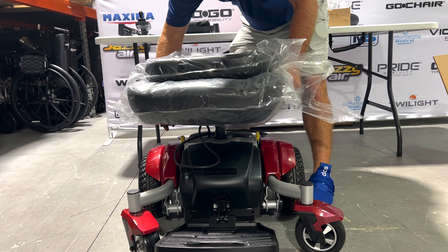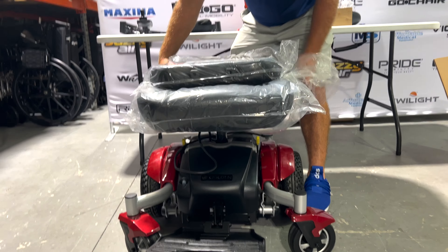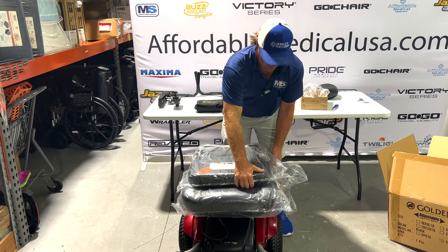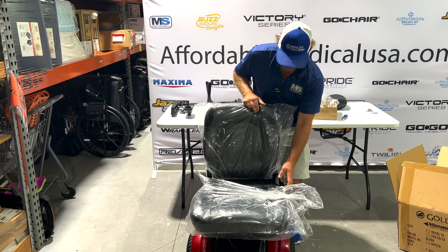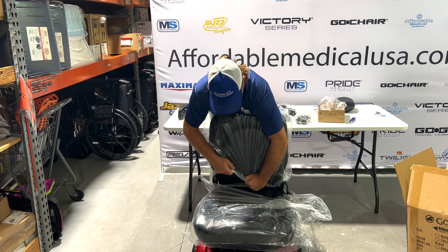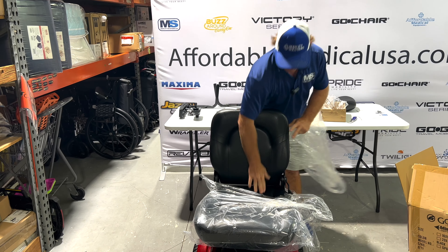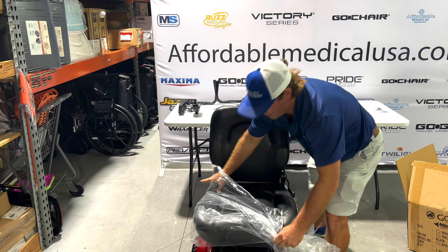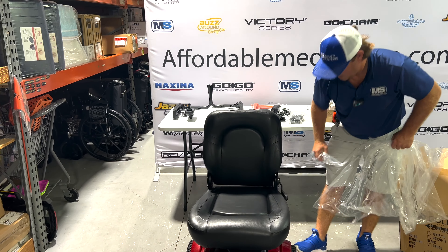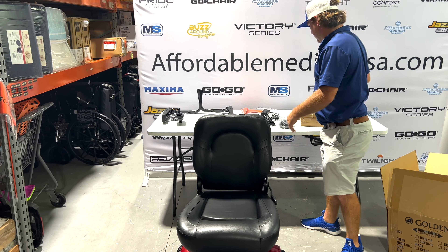There's your swivel — just drop that right on. See how flat it is? When we're putting lifts in cars, that's a cool feature, especially with a lot of compact cars. Looks like they've made the seat better. It's a pretty nice seat compared to what it used to be — it used to be a hard seat. I didn't really like it too much.